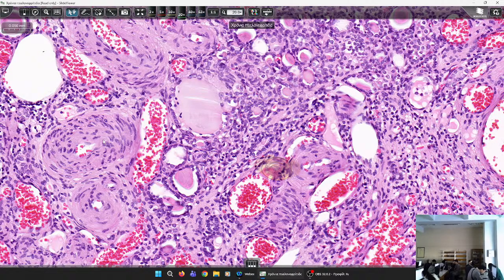Are they glomeruli? No, we do not see the tuft. What can they be? Which part of the renal parenchyma is it? Yes, but that would have a tuft, the urinary space, and the Bowman's capsule. These are glandular structures. They are epithelial structures of glandular epithelium. What are these structures called in the kidney? Yes, they are urinary tubules. So they have become shrunken and atrophic. That's why they are so small.